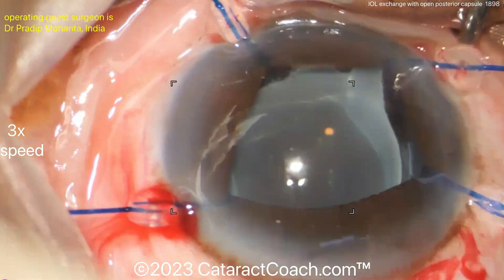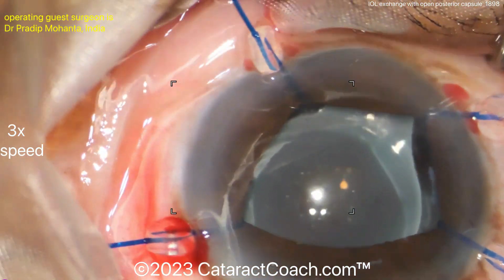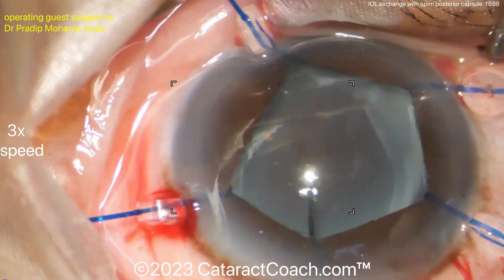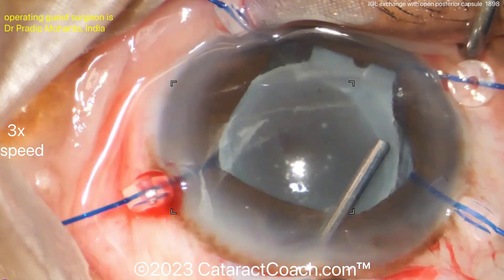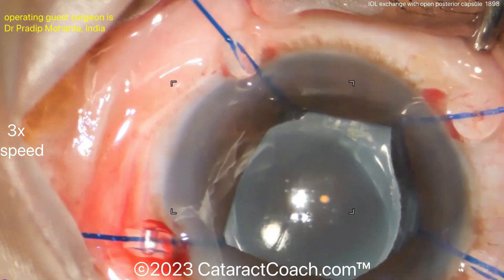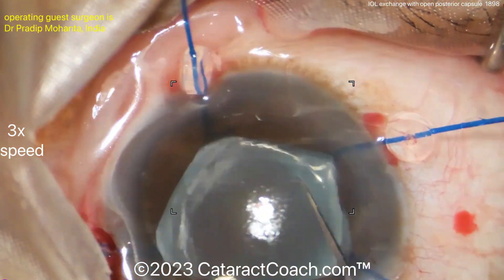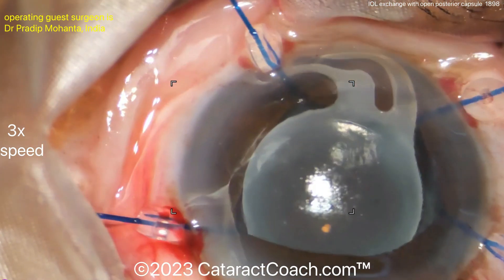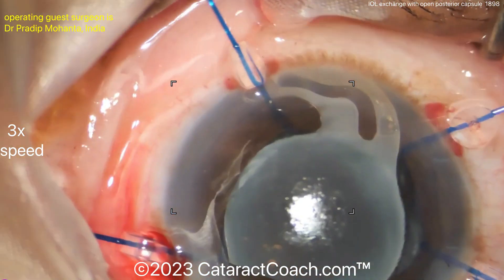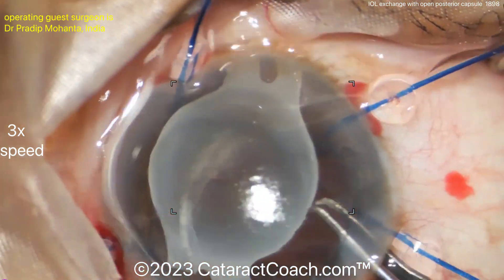Use plenty of viscoelastic — as the saying goes, viscoelastic is cheaper than vitreous. The surgeon is making a very large corneoscleral incision at the limbus. The reason is that sometimes these IOLs, even though they went in foldable, can become opacified — often due to calcification — which makes the lens very hard.